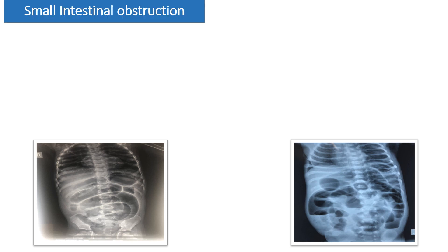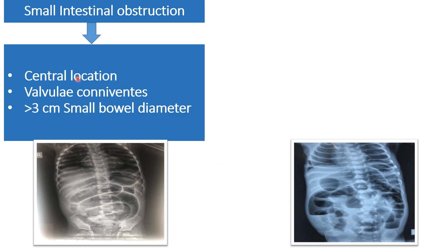How to differentiate large from small intestinal obstruction: whenever there is small intestinal obstruction, the dilated bowel loops will be present in the central part of the abdomen. Whenever there is a dilated small intestine, mucosal folds known as valvulae conniventes will be present throughout the entire circumference — these folds will be visible throughout the entire width of the bowel. Dilatation more than 3 cm diameter is pathological for the small intestine.